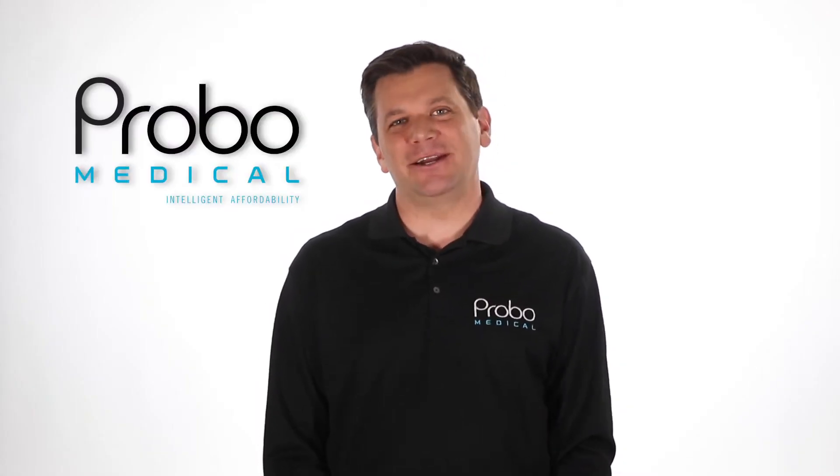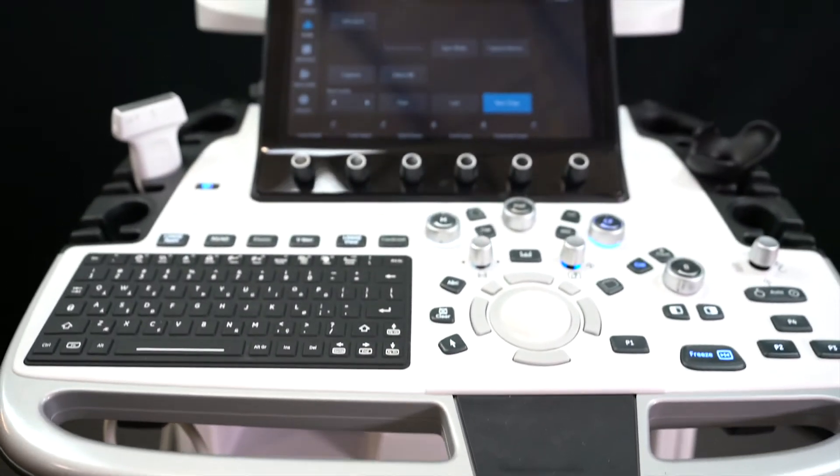Hi, I'm Brian Gill with Probo Medical, and today we're taking a look at the GE Logiq E10 Premium Ultrasound Machine.